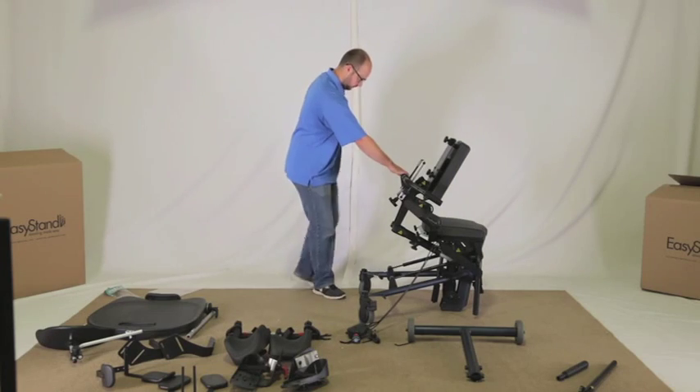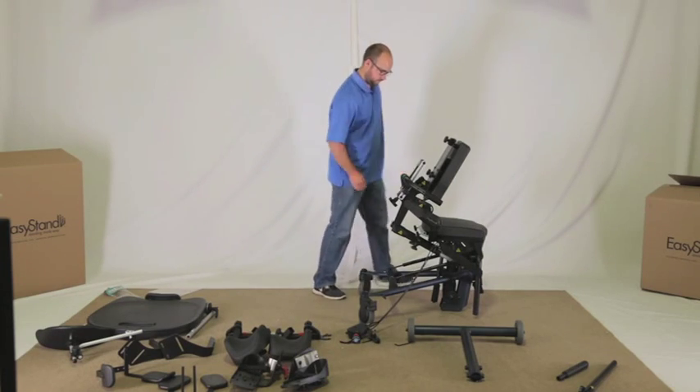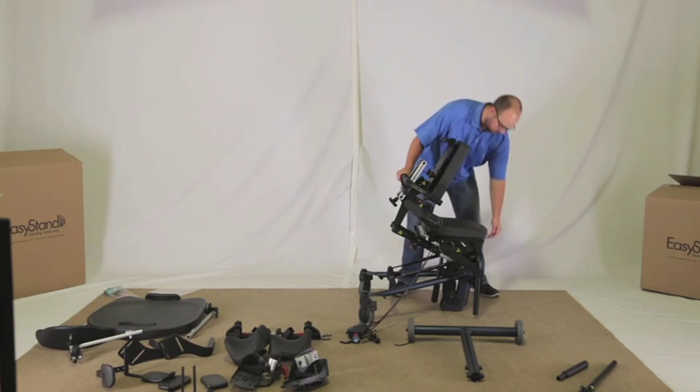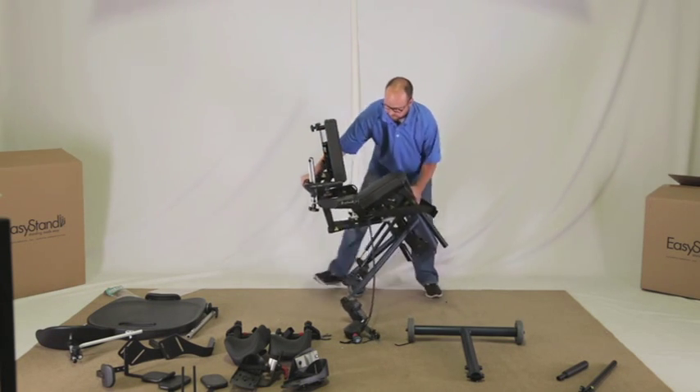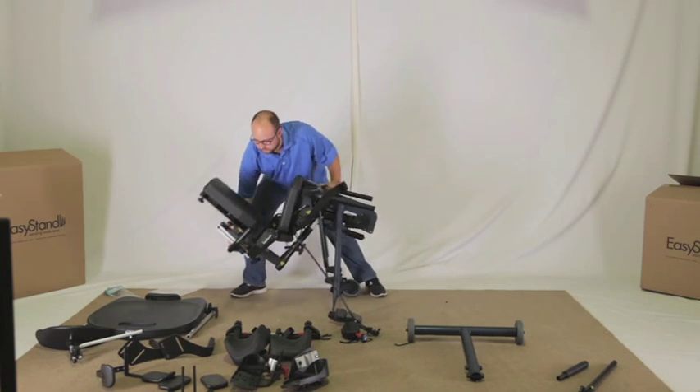If your casters are not already locked, please make sure to lock them. Carefully flip the unit onto its back as shown — you may need an assembly buddy to help assist you with this.